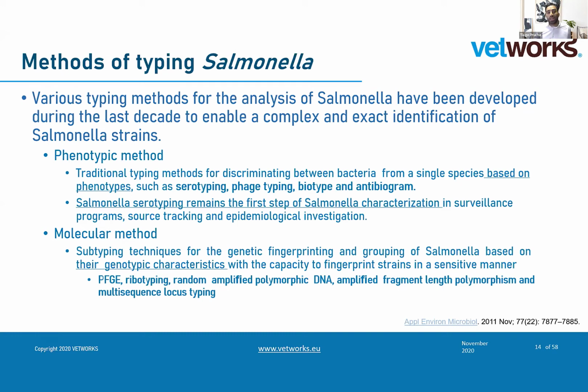And then you have the molecular methods like PCR, PFGE, I will show you in a bit, which are more based on their genotypic characteristics. So it gives you a fingerprint of each strain.